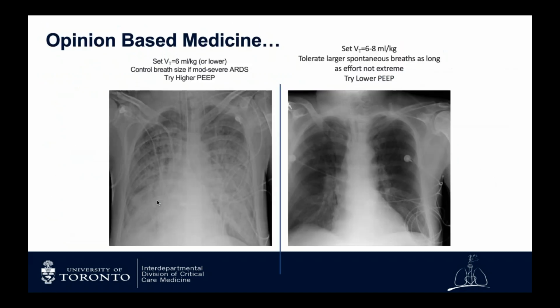So to wrap up, what should we actually do? We're seeing COVID-19 patients present in both of these phenotypes. In this phenotype, with the wet and white lung, severe ARDS, and sort of stereotypically classic severe ARDS, I set the tidal volume to be 6 mils per kilogram or lower to keep a plateau pressure less than 30 and targeting a driving pressure of less than 15. If the patients need to be sedated and paralyzed to achieve that, then so be it.